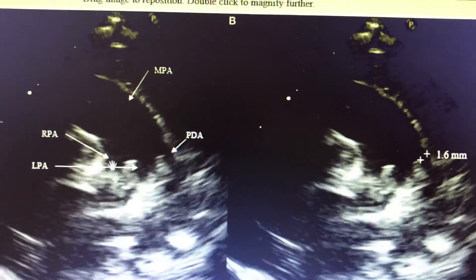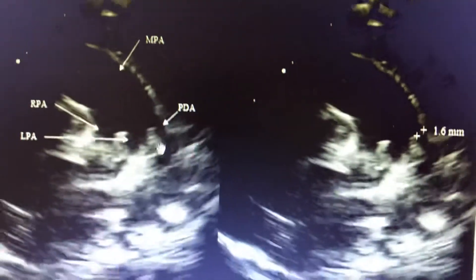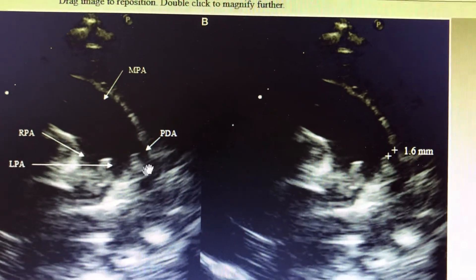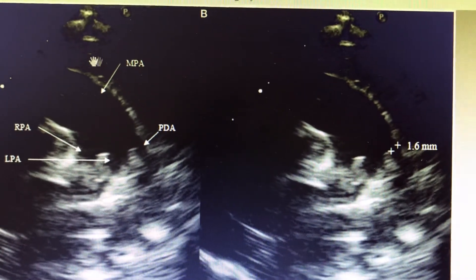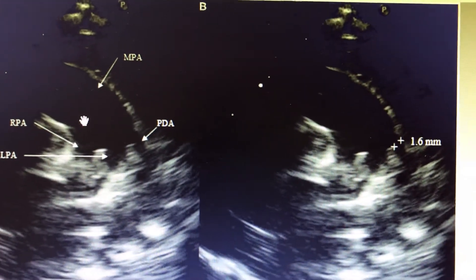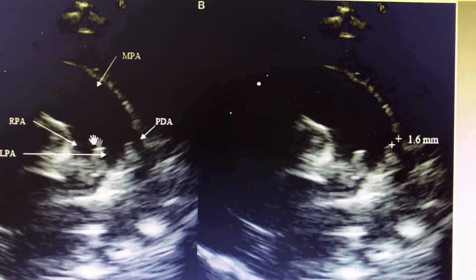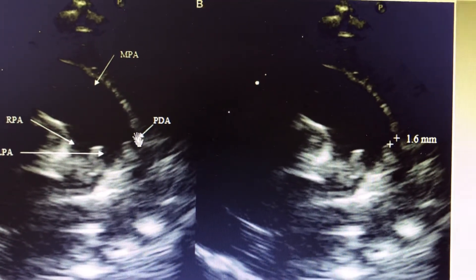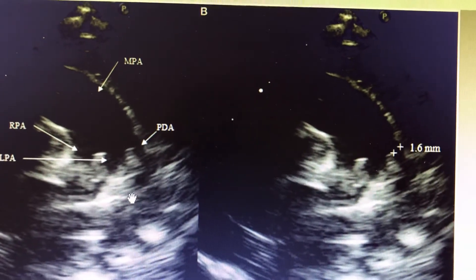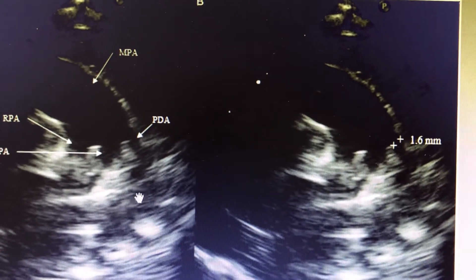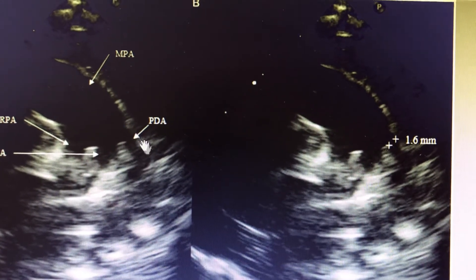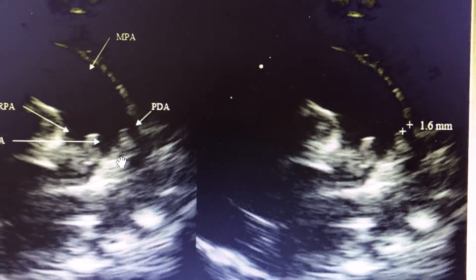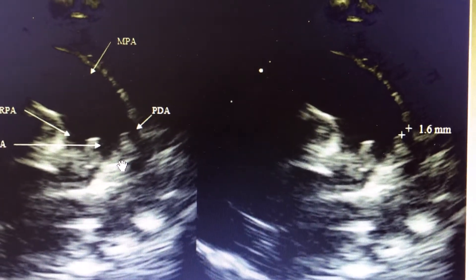As discussed earlier, in the supra-sternal view you get the arch of the aorta, and then slightly getting into a more sagittal section you will get a beautiful opening of the main pulmonary artery, RPA and LPA. Within just the origin of the LPA, you will get a PDA. The arch of aorta is distinct here, and this beautiful PDA is opened here.